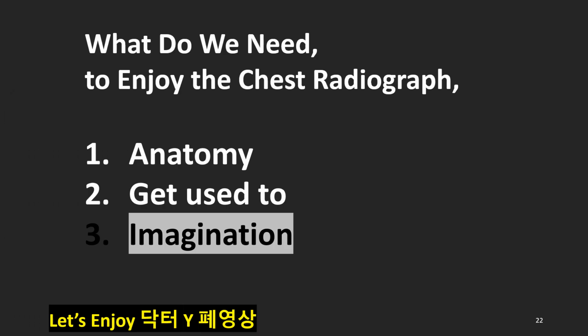Now we are almost there. What do we need to enjoy the chest radiographs? First, at least we should know some anatomic knowledge. And second, let's get familiar, get used to the normal chest radiographic film. And most importantly, we need imagination to make 2D film into 3D original structure.